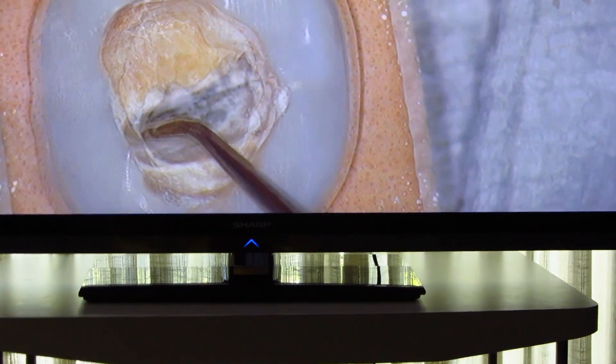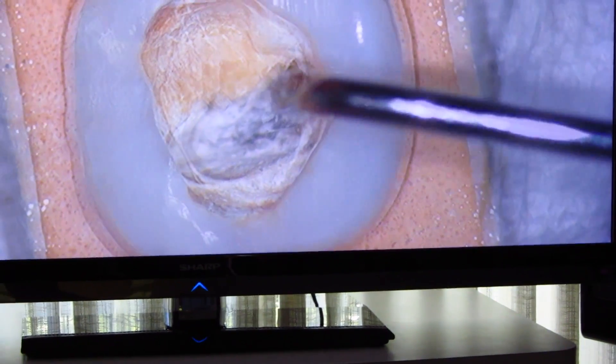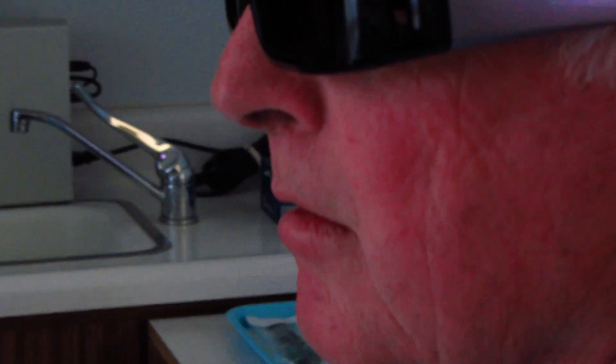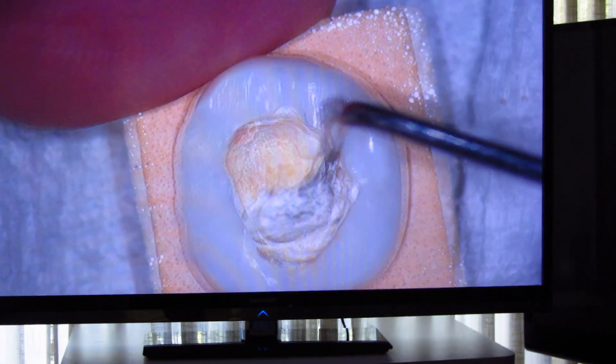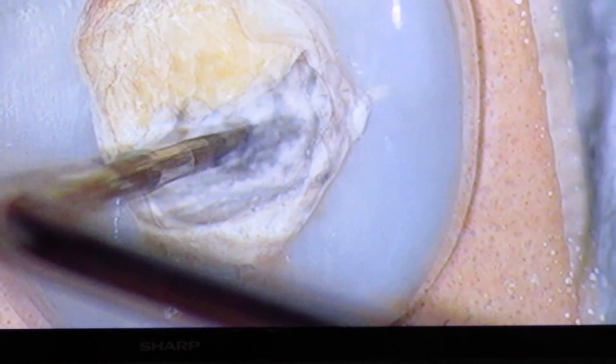Well, give me a perioprobe and I'll tell you how far it is. It looks very good. The depth of field is going to be 10 mm. And this at the highest magnification level? Highest magnification — you're maxed out. Well, it's not 10, it's about... You're not in focus all the way down.